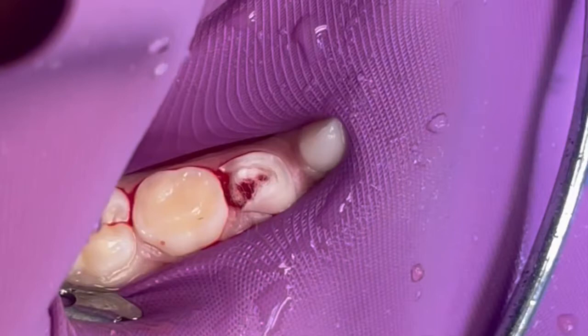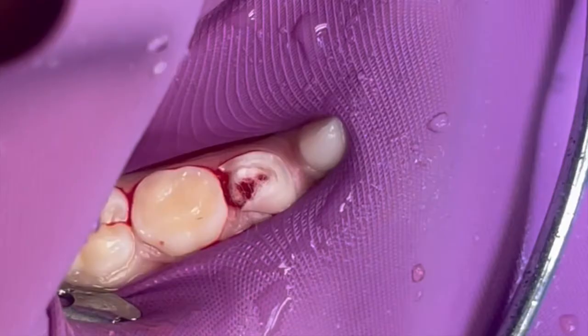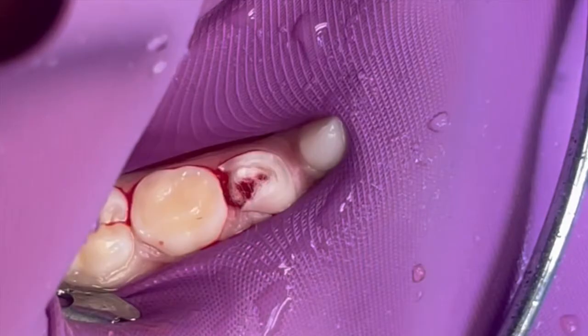In this video, I'm using a size 3 cotton pellet that I pack into the tooth to allow for pressure hemostasis. This is the most difficult part of an MTA-style pulpotomy — we are relying on pressure hemostasis to tell us the vitality of the more apical portions of the pulp. When we think about formocresol or ferric sulfate pulpotomies, we're actually getting hemostasis from the caustic nature of those agents. Sterile saline doesn't really aid in hemostasis at all; the heme coming from the pulp fills up the cotton pellet, so applying pressure is almost just liquidating those pellets.